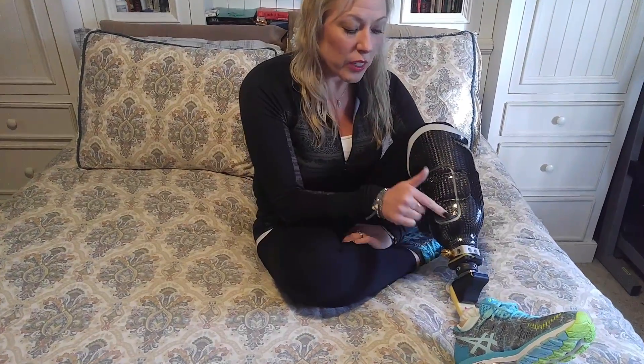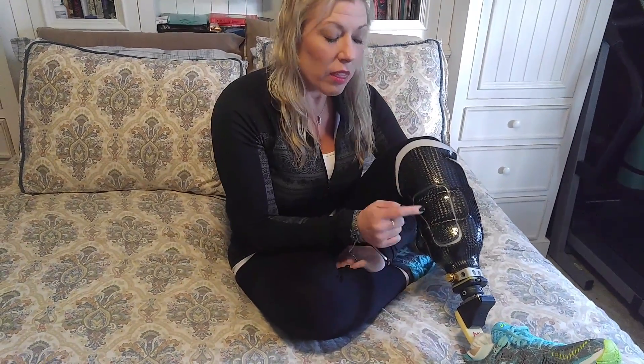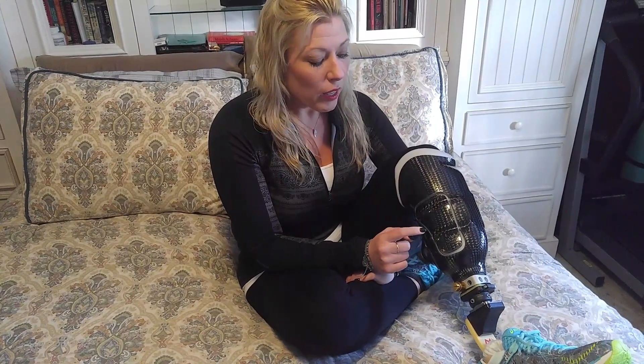As you guys can see, you can see these little panels on here. This is a Revo Fit from Click Medical and it's awesome for brand new amputees. We're going to share some really cool features about this, and my husband's going to dive in and give you some really good information on how it works and why it's so great. So we're just going to go ahead and take this off and hand it over to him.